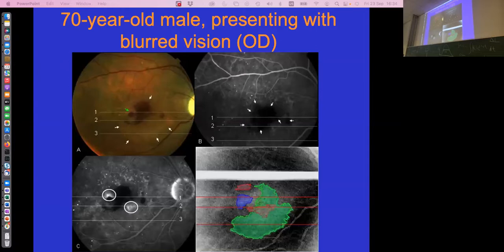How did they diagnose this disease? You get new blood vessels and they're leaky. That's the problem. So you inject a dye in the bloodstream, shine a laser in the back of the eye, and look for the fluorescence. That's called a fluorescein angiogram. This is the early phase, where the arteries are filling up with dye. And this is a late phase, where it has gone through the veins and been collected by the liver. That goes very fast, in about 5 minutes.